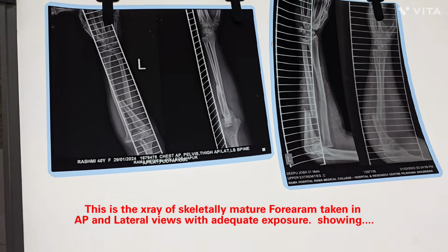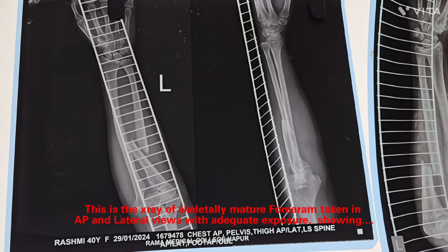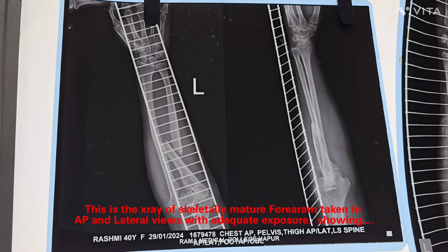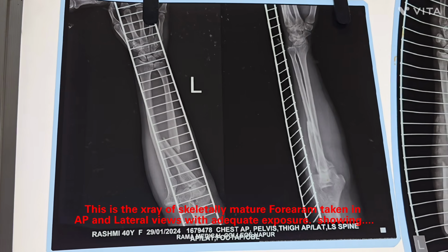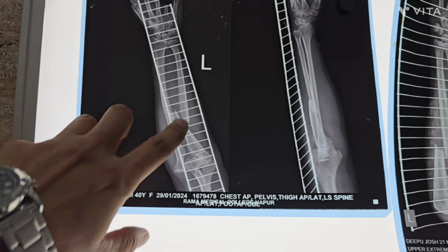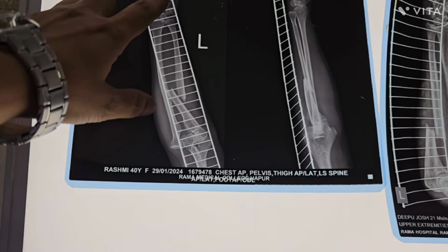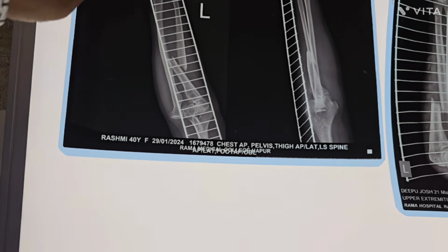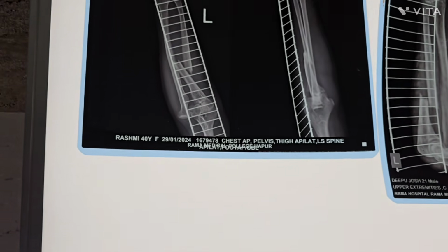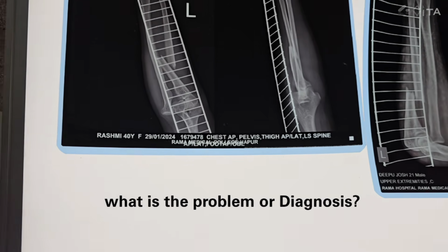So you can start like this. This is the X-ray of a skeletally mature forearm taken in AP and lateral view, showing the bones like radius, ulna, distal part of humerus, carpals and metacarpals. Also there is some support which is called a Kramer wire support. So in this X-ray, the next question will be asked about what is the problem.